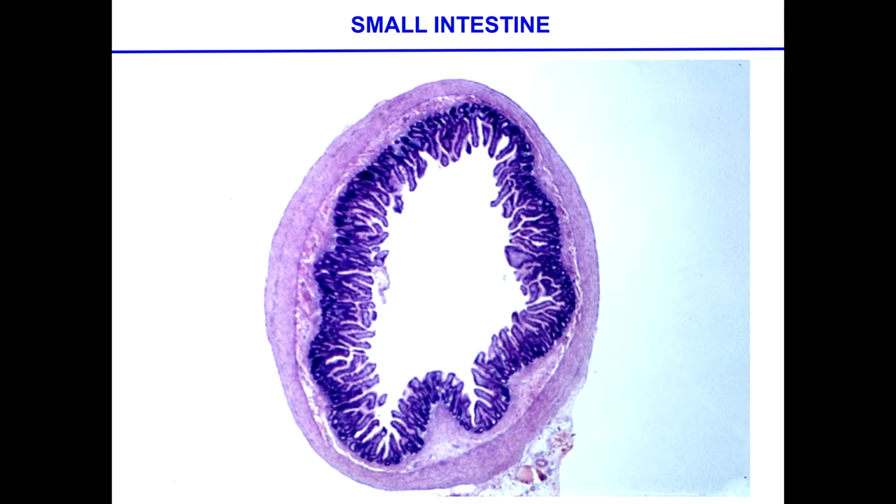That is called the mesentery, and that's the mesentery portion that has remained with the preparation. This is not a nerve ending, even though it looks like one of those button things, and it might even have physical-looking stuff inside. Okay, it's not. Questions?